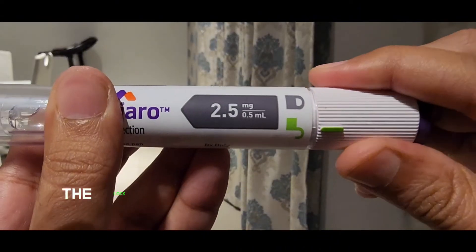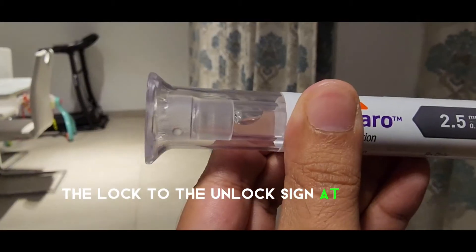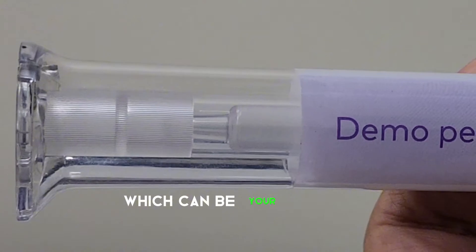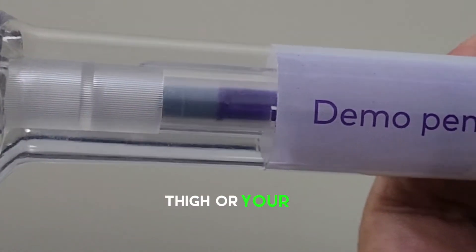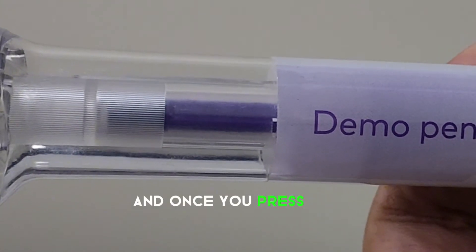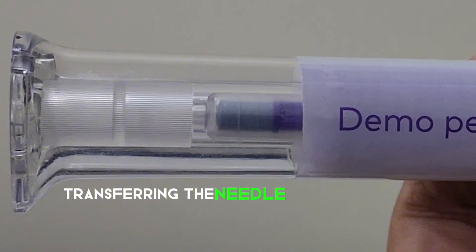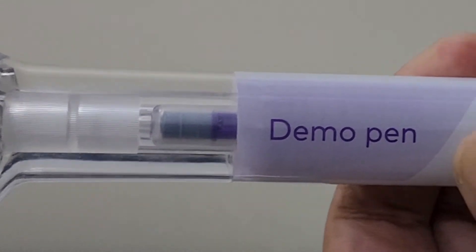you have to move the lock to the unlock sign at the back of the cap, and place the pen device at the site of injection, which can be your abdomen, thigh, or arm. Once you press click, you will see the stroke going in, transferring the needle, and retracting the needle.